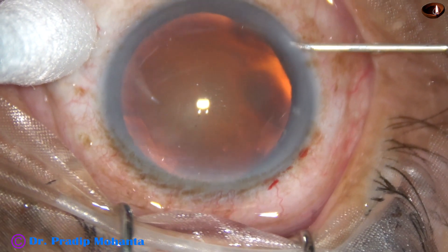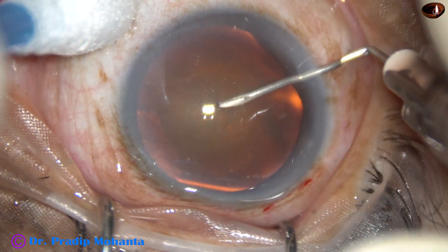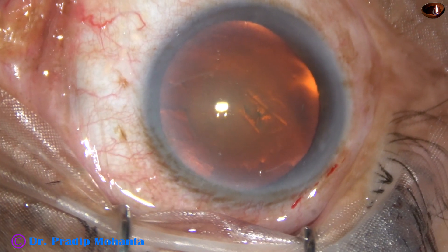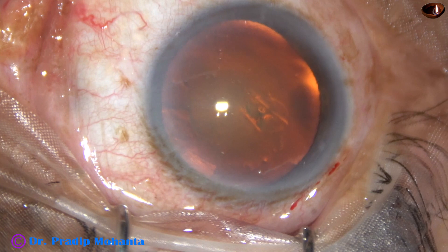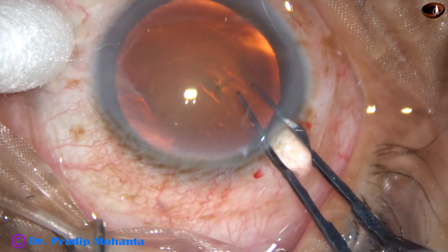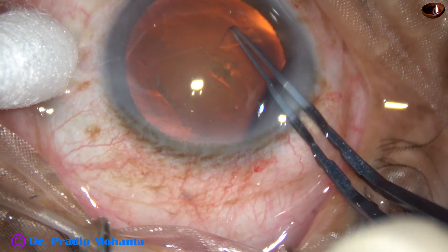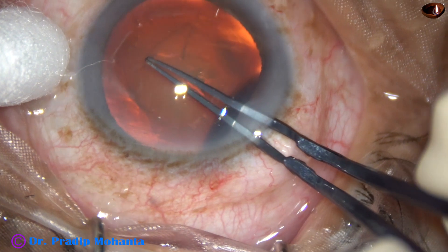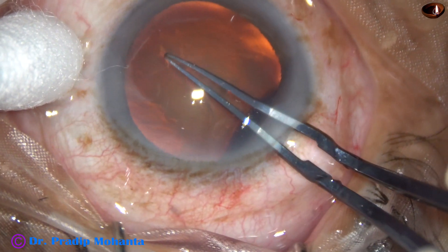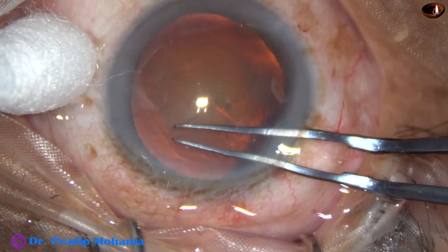Use a 26-gauge bent needle cystitome to incise the anterior capsule and raise a capsular tag. Then use utrata forceps. You can complete the rhexis by the needle itself, but if you use the utrata forceps, always keep the anterior lip of the main wound lifted up, so that leakage of viscoelastic becomes very less. Release and re-grasp and complete the rhexis.